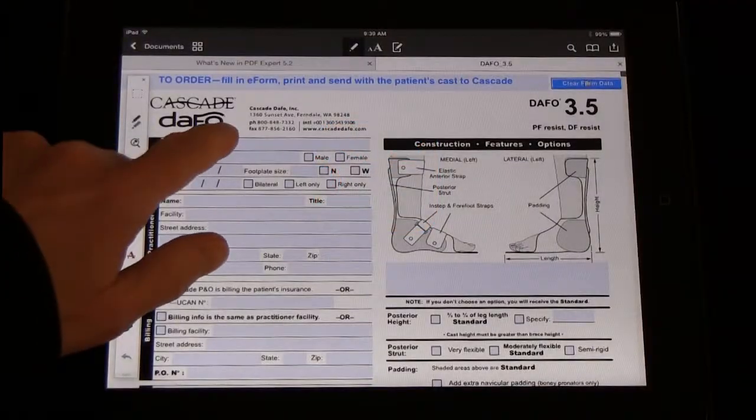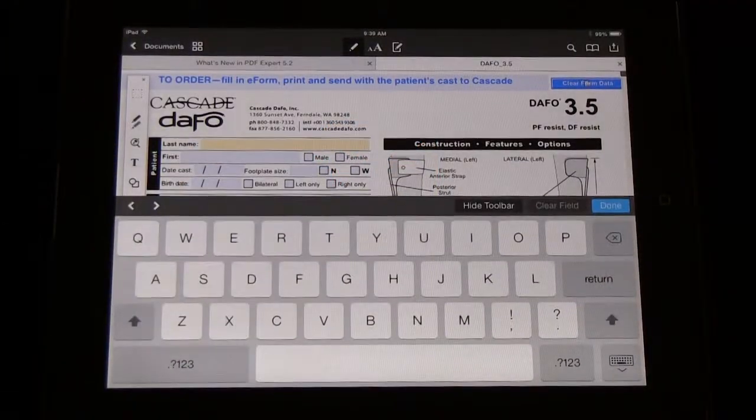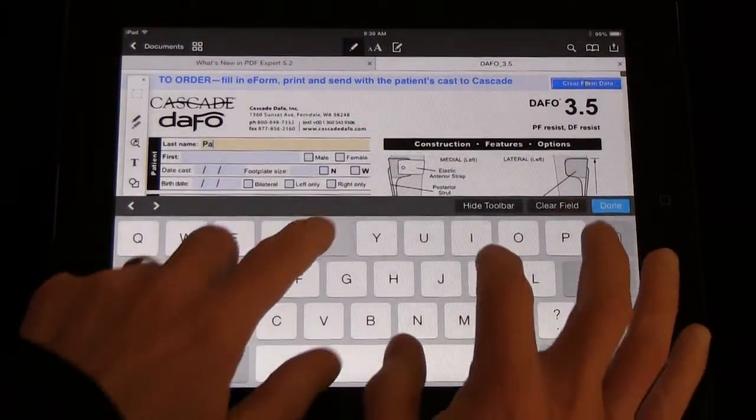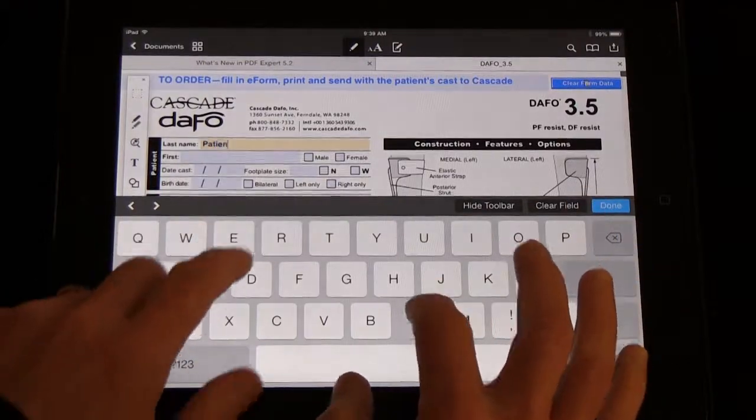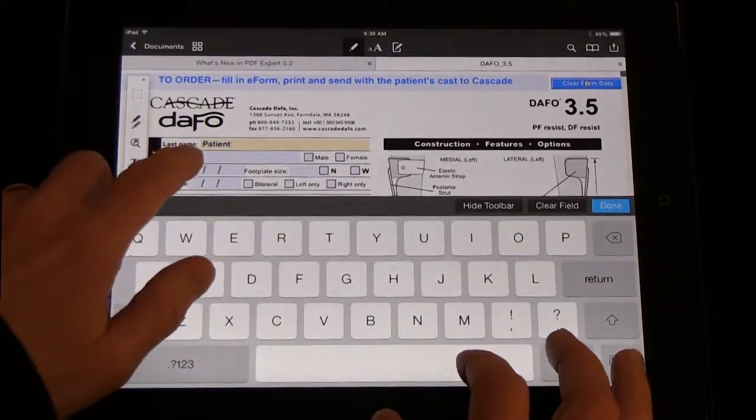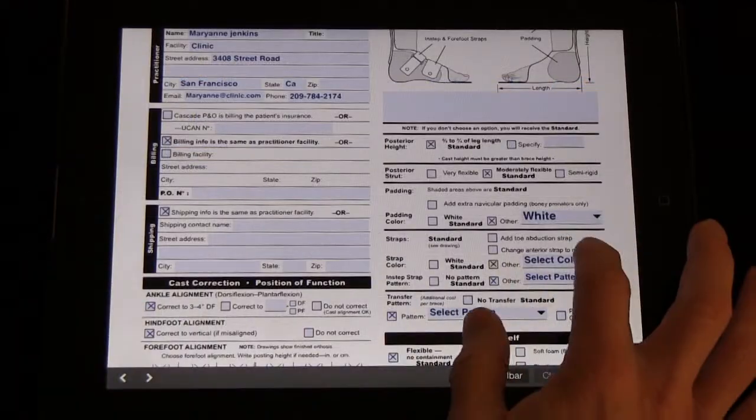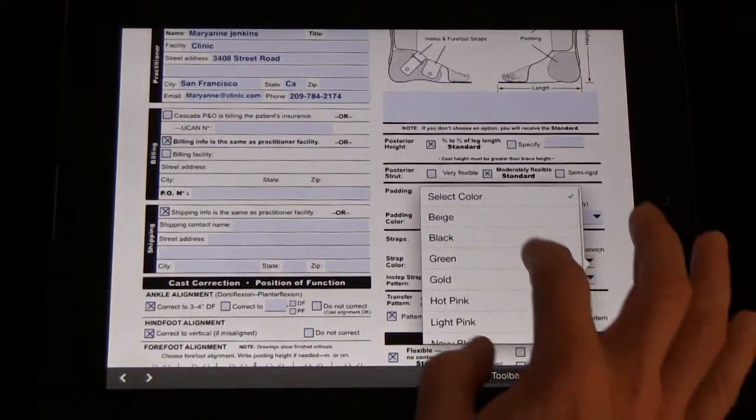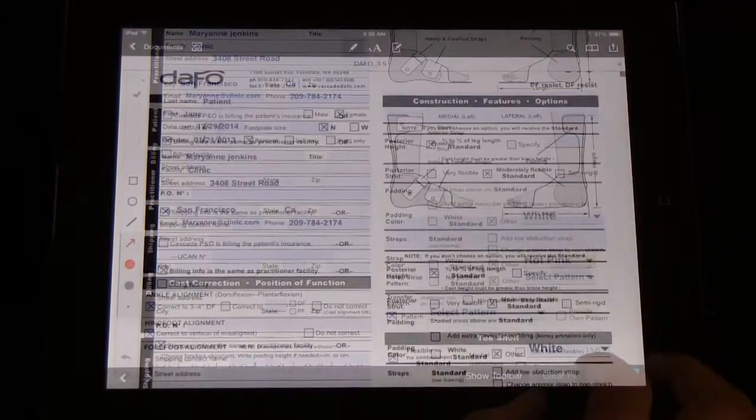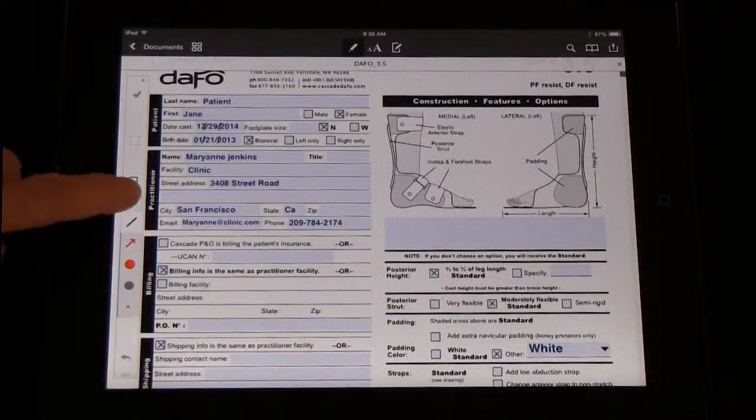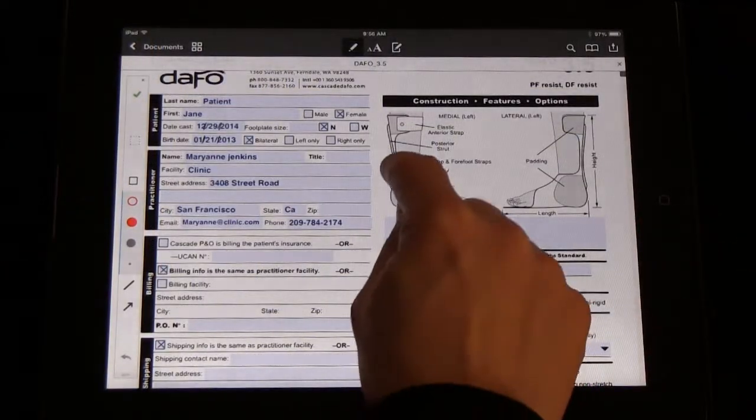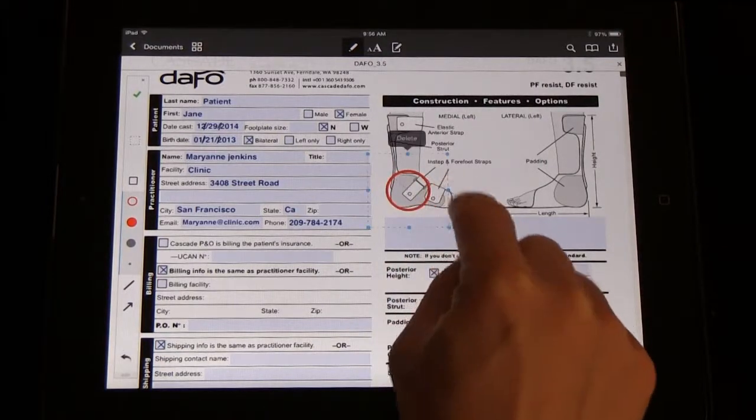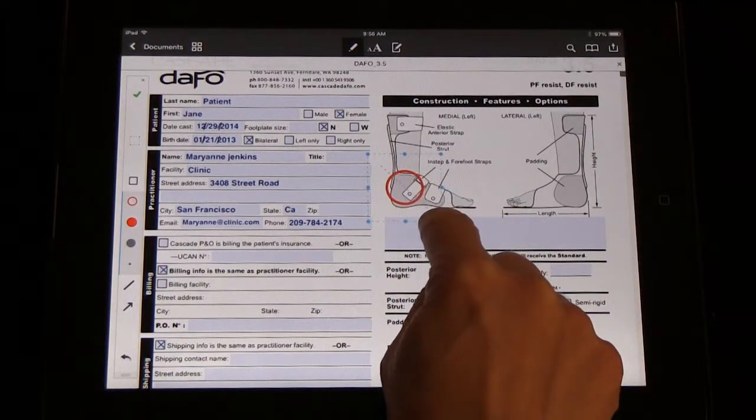We have found PDF Expert to have better functionality with our order forms than Adobe Reader. The drop down menus work great and the easy drawing tools are handy for drawing in specific features on the Brace Illustration.